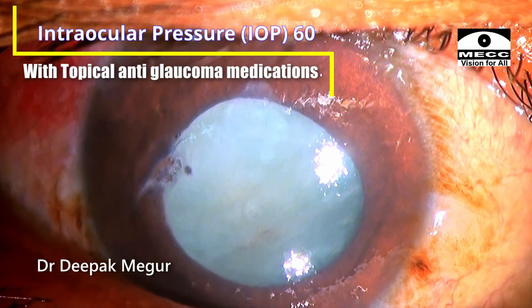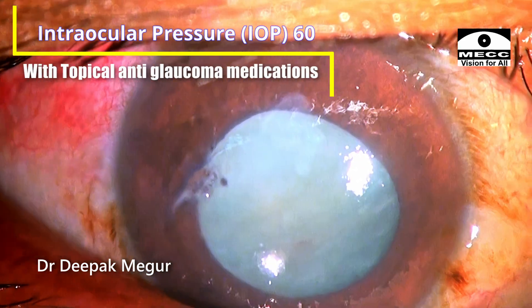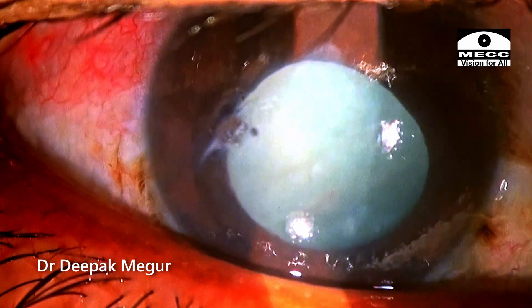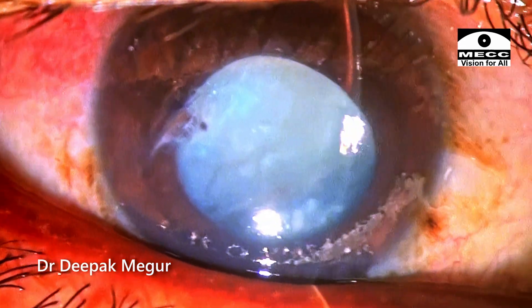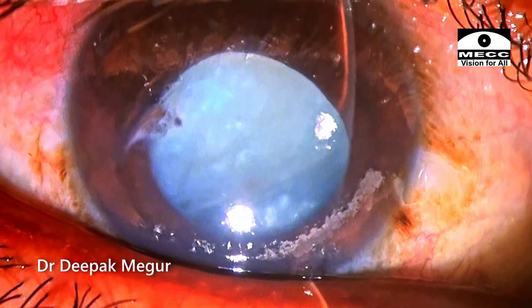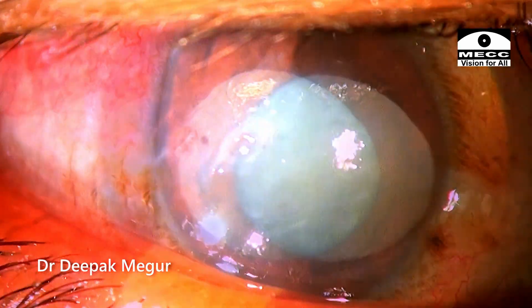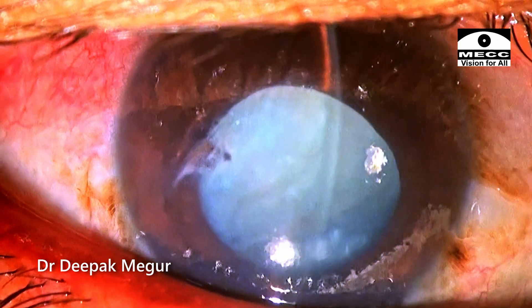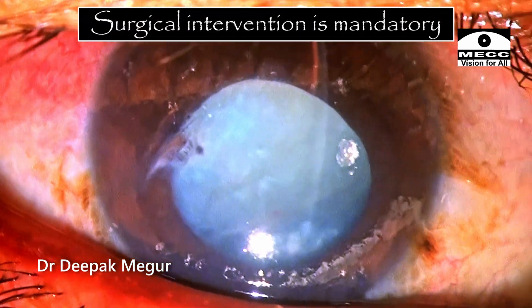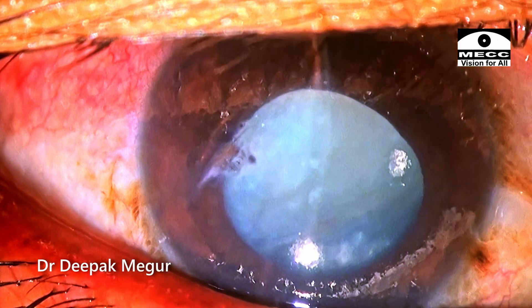On the day of the surgery, the pressure is 60 with all topical anti-glaucoma medications. She has been on treatment with topical antibiotics, steroids and anti-glaucoma medications for the last three days. Medicines are not going to get the pressure down — the mechanical obstruction needs to be dealt with and hence surgical intervention is mandatory to save this eye.